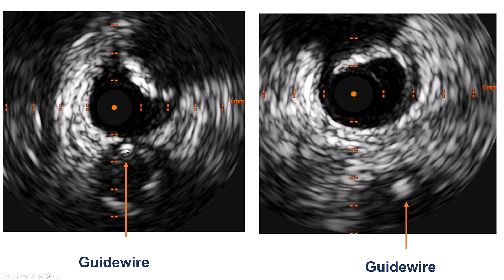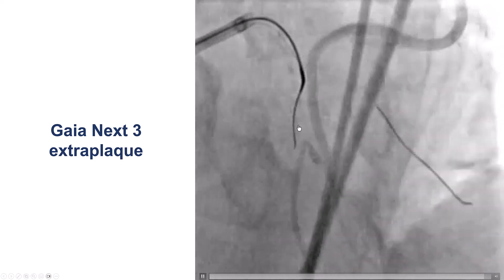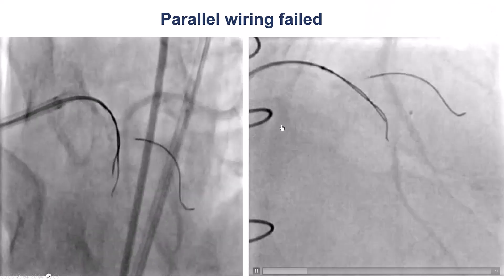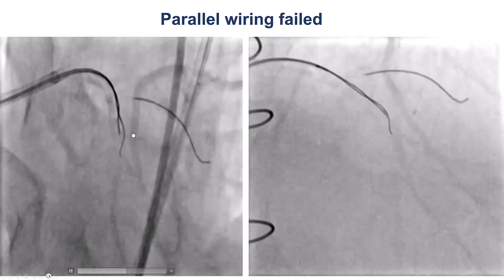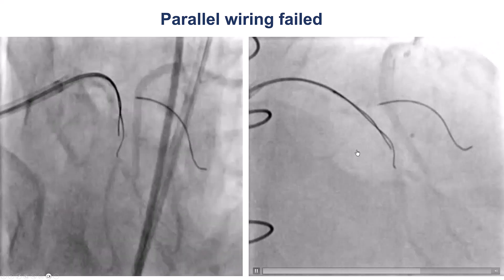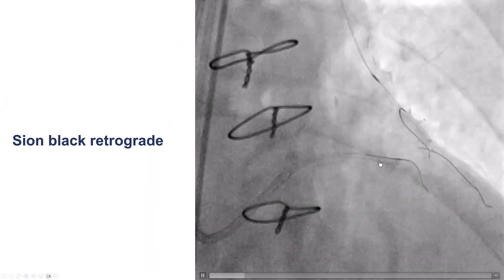The guide wire is getting in — it's a little eccentric, but continues and is within the LAD architecture. However, when we did the injection from the LIMA, the guide wire was in the extraplaque space. We decided to use parallel wiring, leaving the first wire in place and using a second Gaia wire. That wire seemed to go in the right direction, but on contralateral injection from the LIMA, it was also in the extraplaque space.